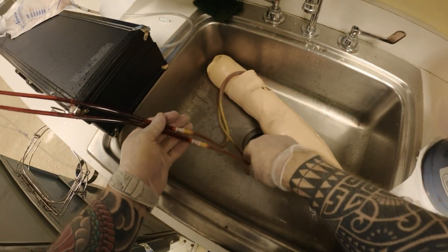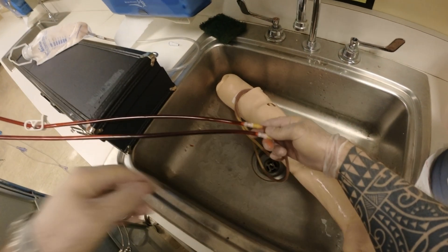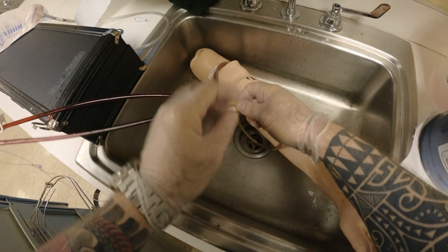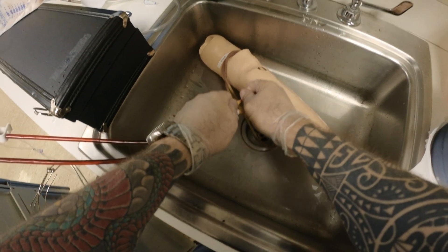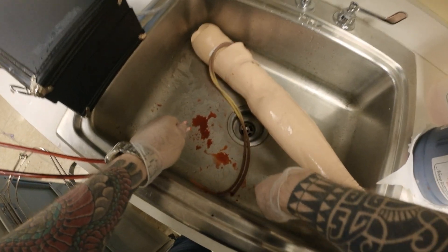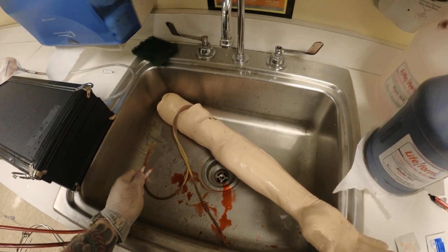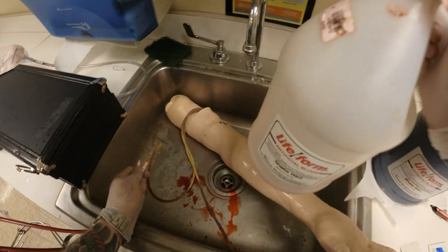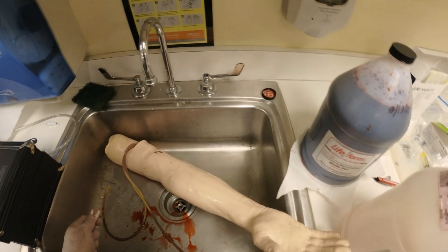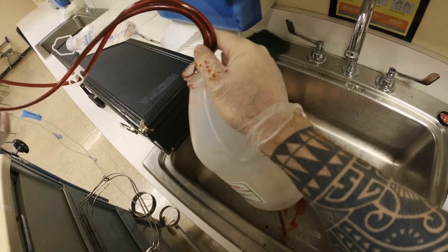I bring both of these tubes close to the sink. This is closed and this is closed, so I'm going to go ahead and open them. This is some of the fake blood that was inside the tubing. This blood in here I want to reuse, so I take my container and put both of them in here, then open my clamps.